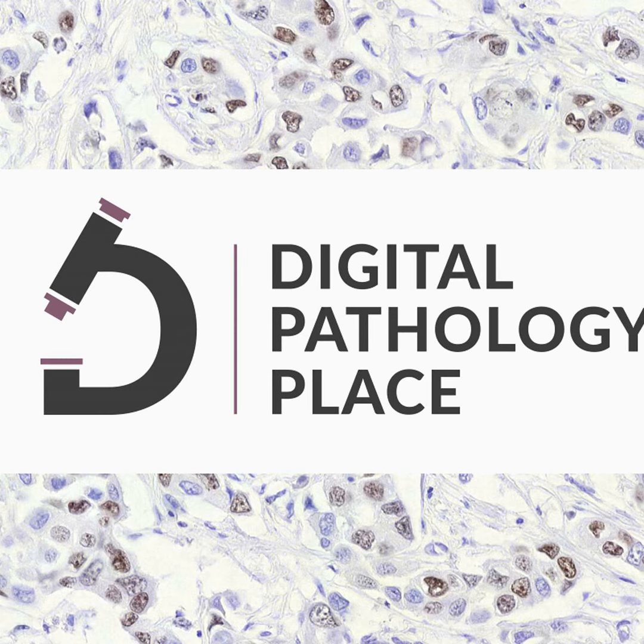Then I decided that in order to do this, since I didn't personally have the money to do it, I started a GoFundMe account to raise some money and purchase what I needed to set up a telepathology system. Telepathology allows me to look at what's under the microscope in real time over the internet. So I began raising funds. I raised several thousand dollars, and I was able to get a computer and a microscope with a teaching head. However, the one thing that was very expensive, and I was trying to raise more money, and it is ongoing, is the camera system that allows me to transmit things over the internet and help them in real time. And Gabe so generously reached out and donated a camera from Augmentiqs, and I think he can tell you a lot more about that.